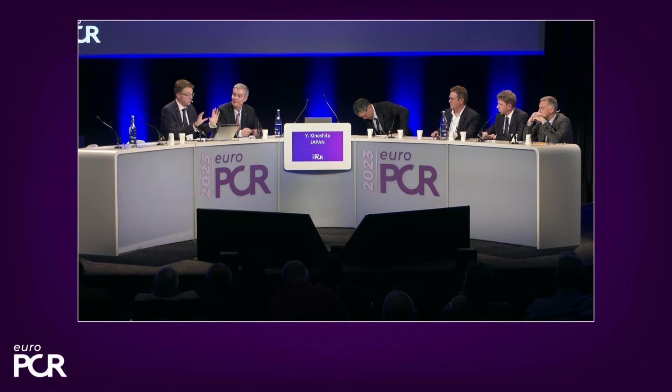So we've had lots of stuff around the procedure, but I wonder, Yoshi did then bring it back to the high bleeding risk patient. And so there have been a couple of questions around both peri-procedural anticoagulation. Do we have to do anything different? And then maybe we move forwards to beyond the stenting.